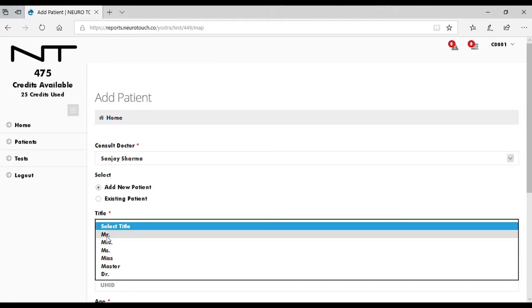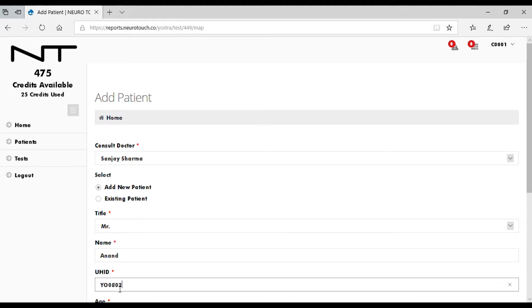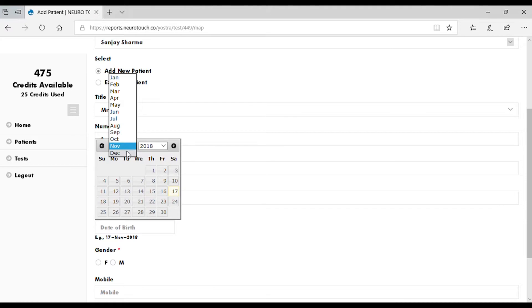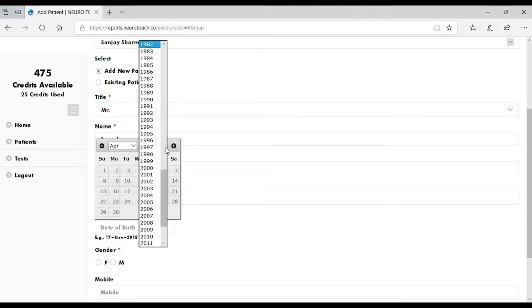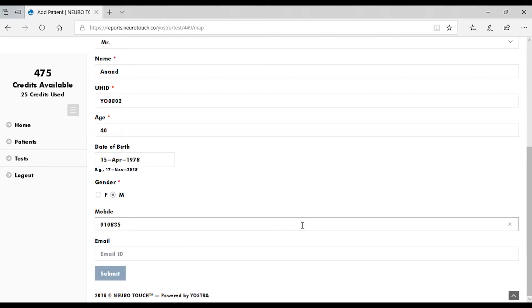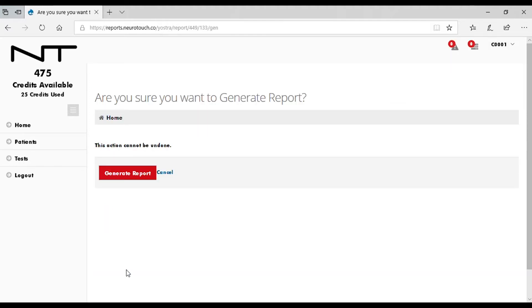Add a new patient by filling the form as shown. Once done, click on Submit. You will get a confirmation message.